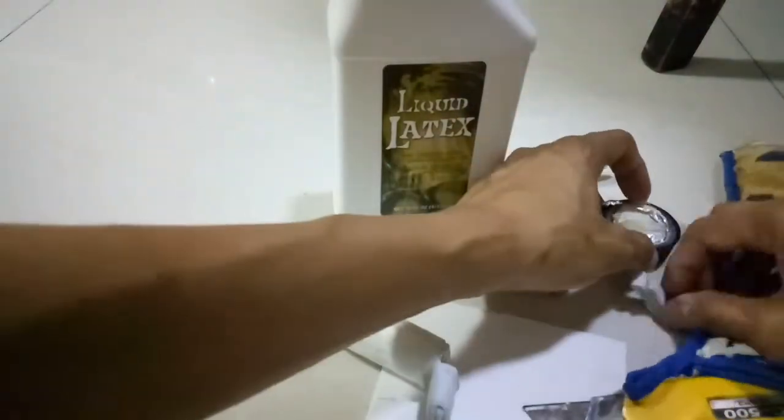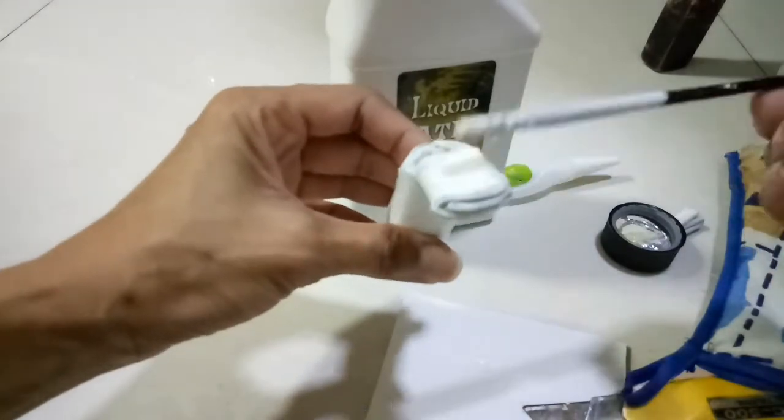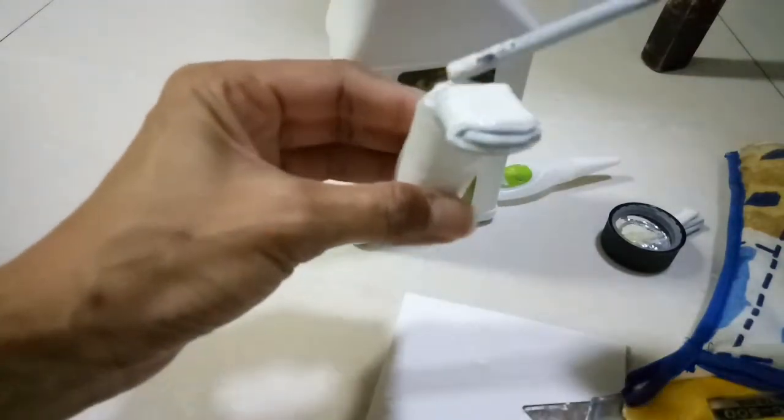Now we're applying liquid latex on the bottom part of the paw of our prosthetic leg so that Donnie won't slip when he's using it. After that, I actually placed a piece of cloth so it's going to be soft on his skin.